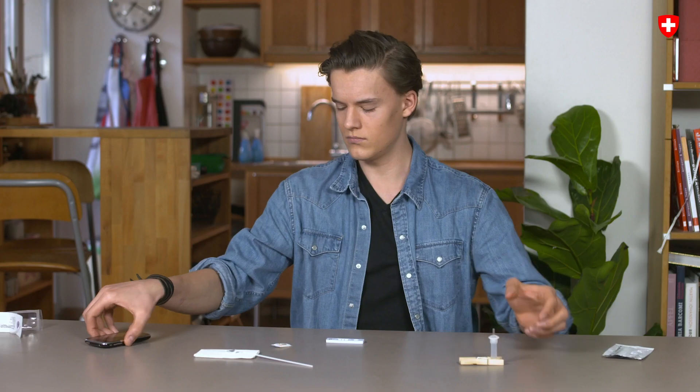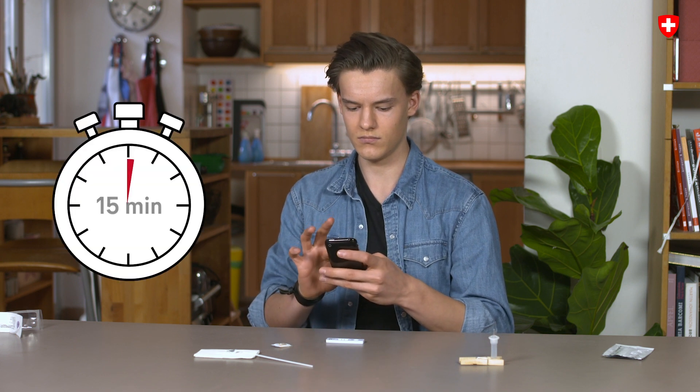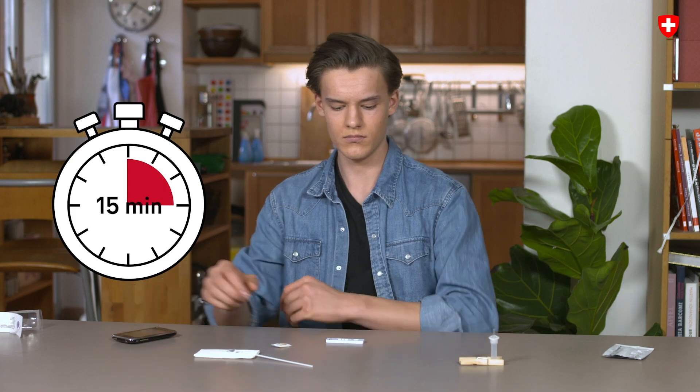Step 7: Start the timer. The result can be read off after 15 minutes. After more than 30 minutes, the result is invalid.